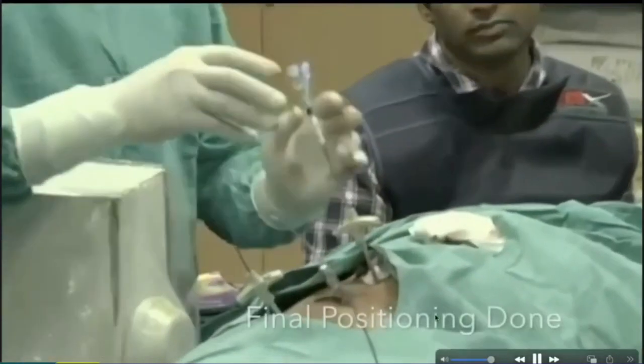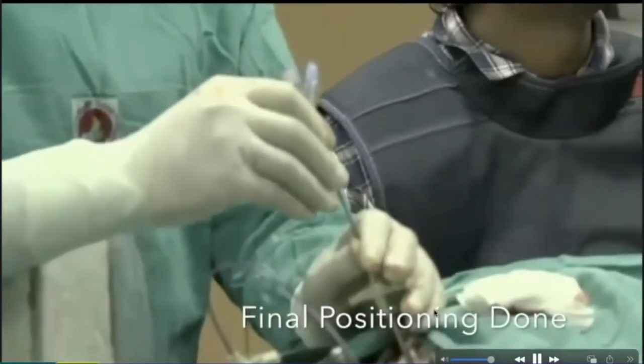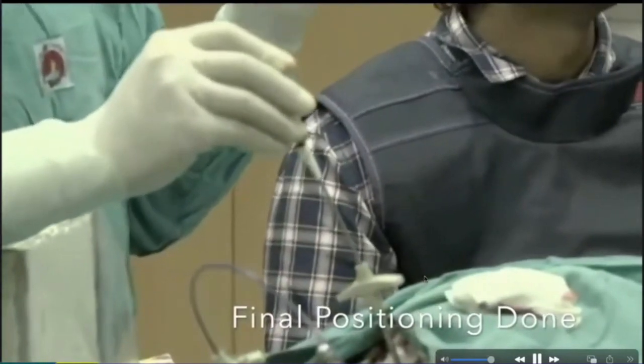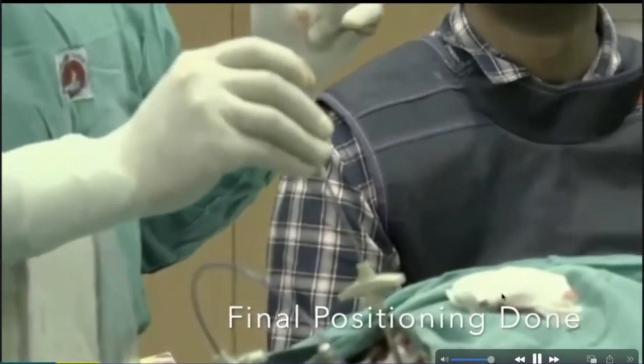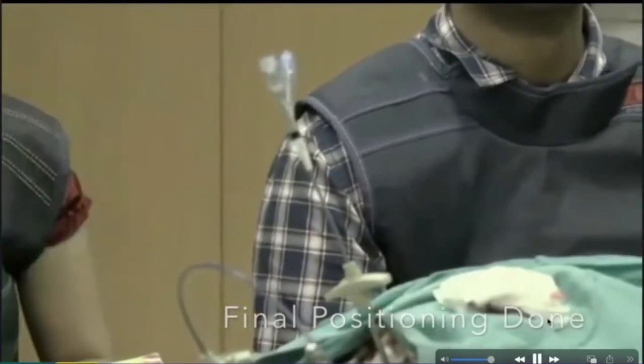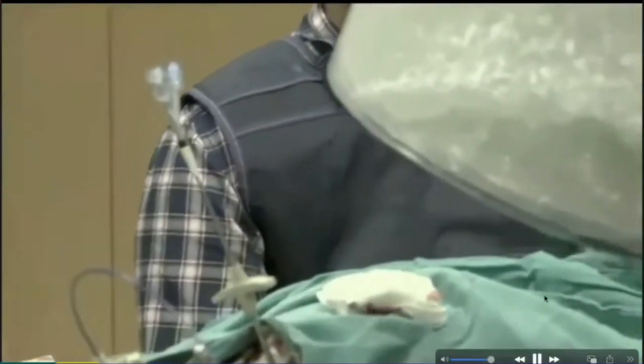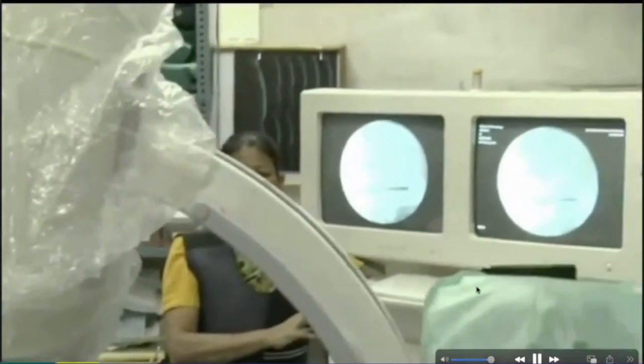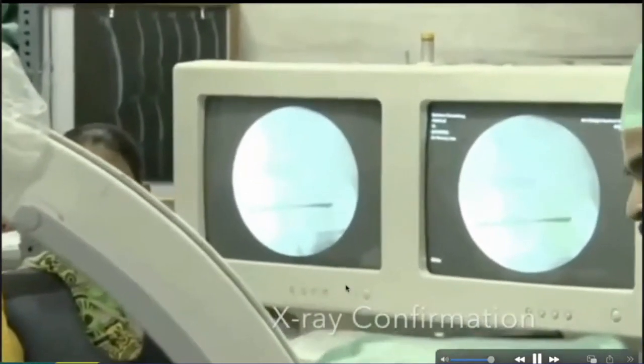Most likely, yes, close to that, because the balloon is just behind that. So you can take this up to the anterior margin or anterior body, and then you start inflating it, and you will see this. Keep taking AP and lateral. This is very, very important. This is a very fluoroscopy-intensive procedure. Do not miss that, because if you leak cement in, this is going to be a straightforward surgical case.